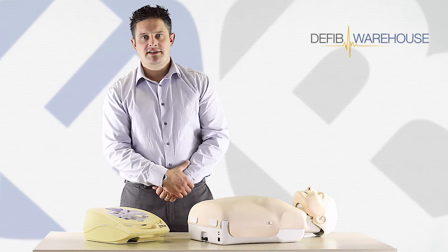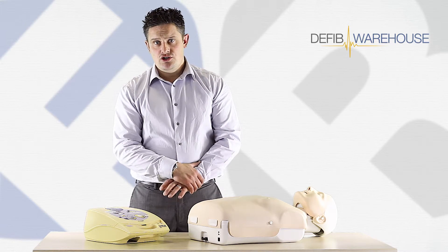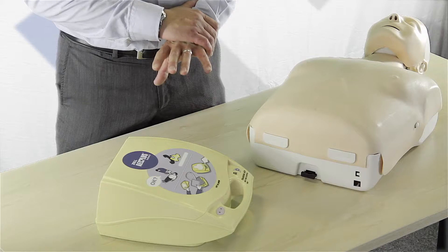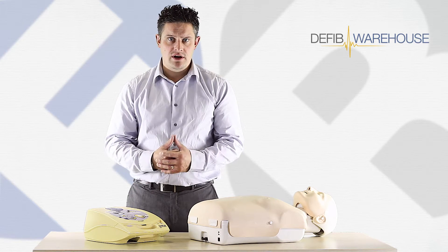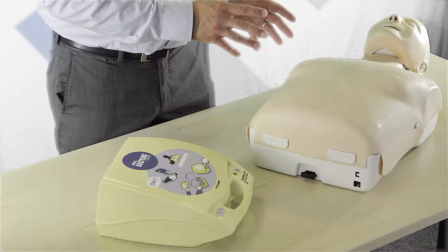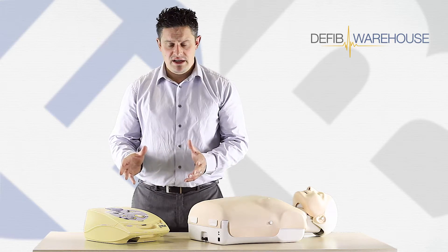Welcome to Defib Warehouse, part of First Rescue Training and Supplies Limited. In today's short video we're going to see the Zoll AED Plus Trainer 2 in action. We're going to go through the basic functions and a very quick demonstration of applying the pads to the chest of a mannequin, so you can see how the machine reacts in its basic form.